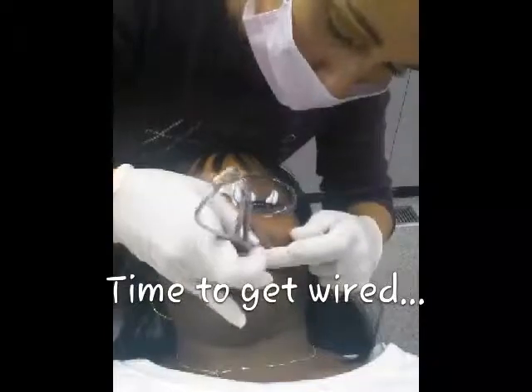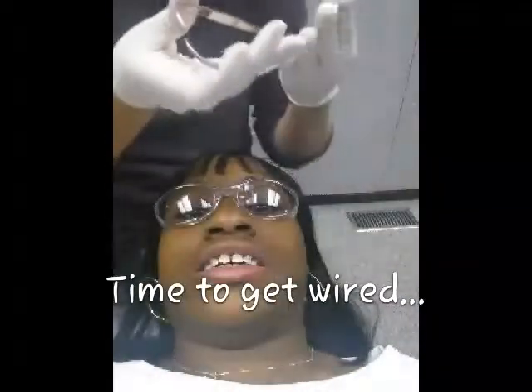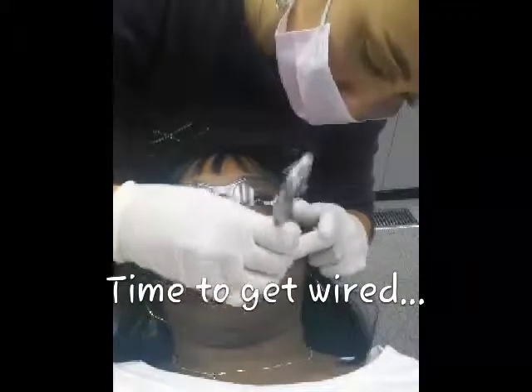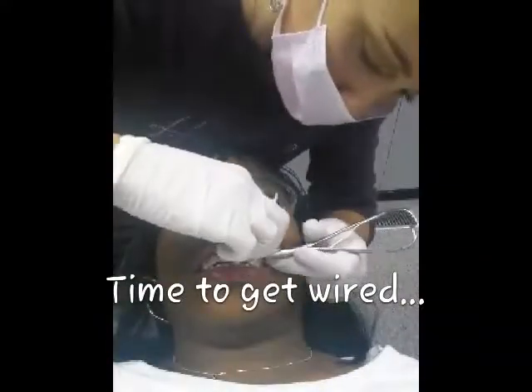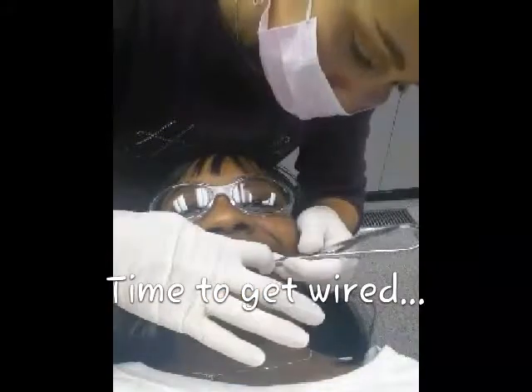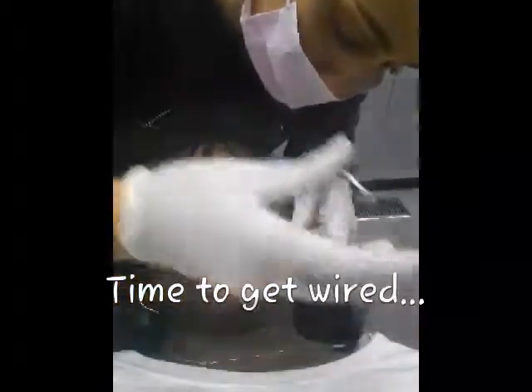And there was another dental assistant who had braces, and she had the pearl because she said that the clear will sometimes stain, like if I'm a coffee drinker or, like a lot of sauces, like barbecue sauce or hot sauce, it'll stain, or even mustard. She said if I have mustard, the clear will stain and it'll be yellow. So each of my brackets will look like they have a yellow rubber band around it. So I didn't want that. So I chose the pearl, and so that's just her placing the rubber band around each bracket.